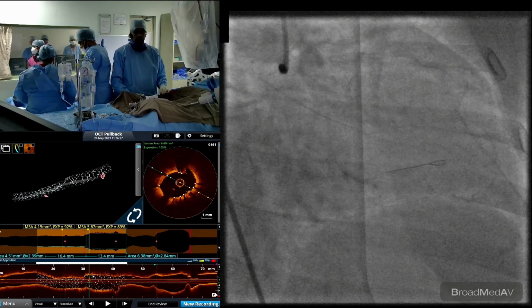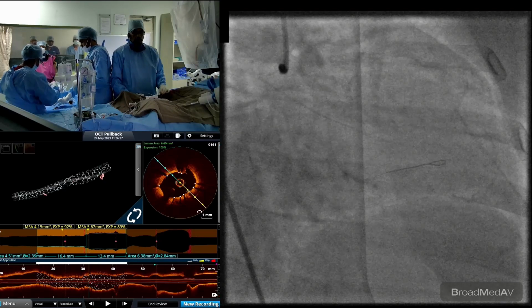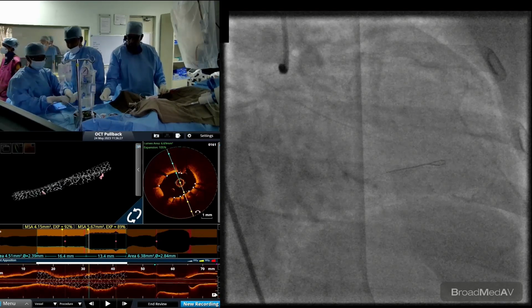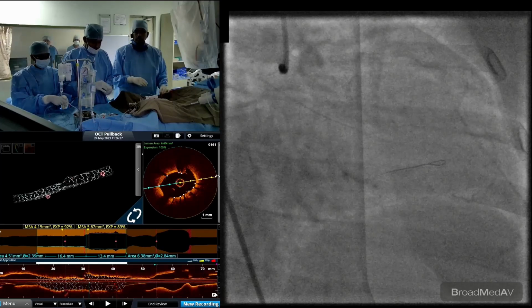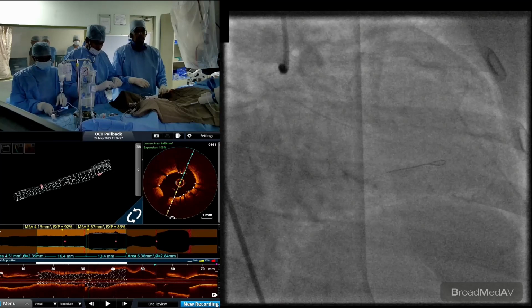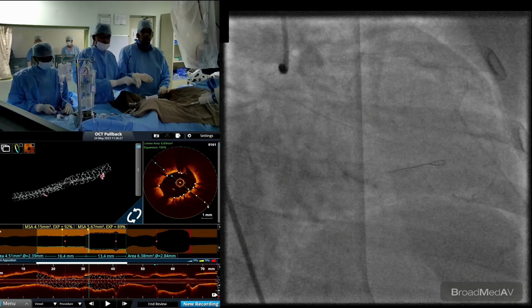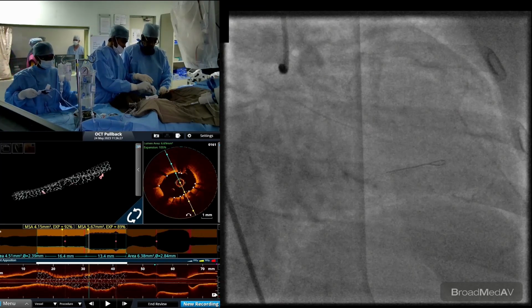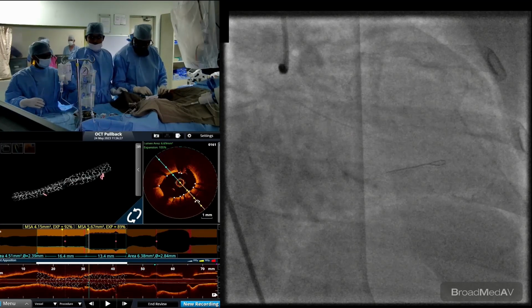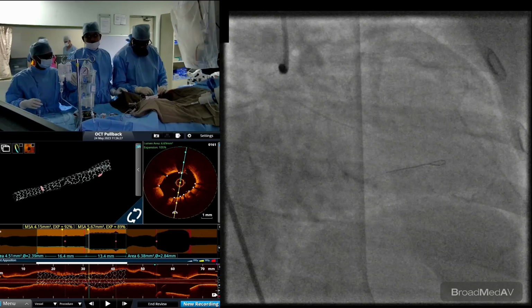Before the diagonal, the expansion is 89%, and after the diagonal, 92%, which is reasonably good expansion, no malposition. And here in the OCT, we can see clear images of the stent only view, what all the connector points are and how the LAD is nicely opened. I think at the end of this, after seeing the image, we can go to bed happily.